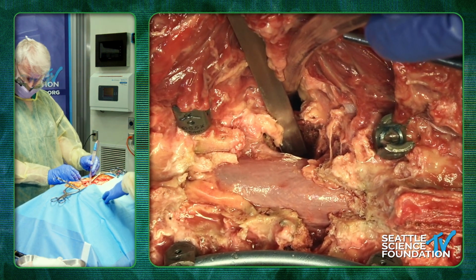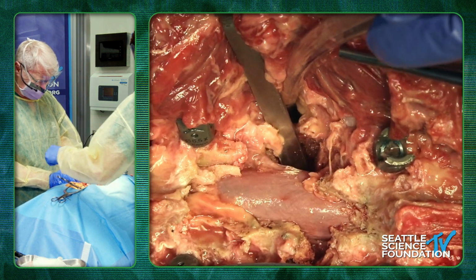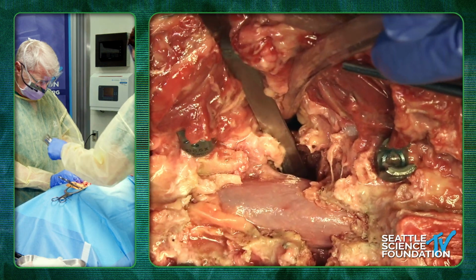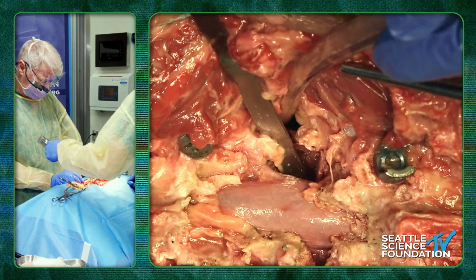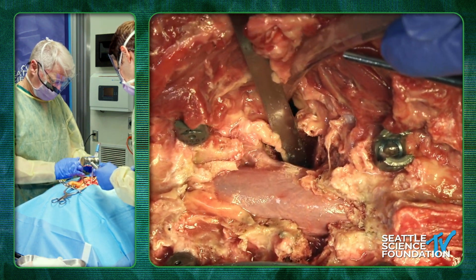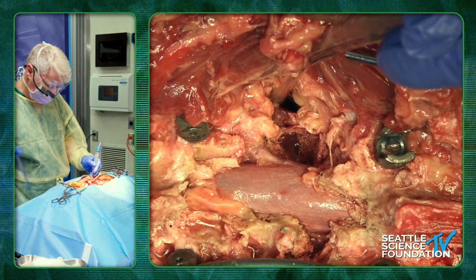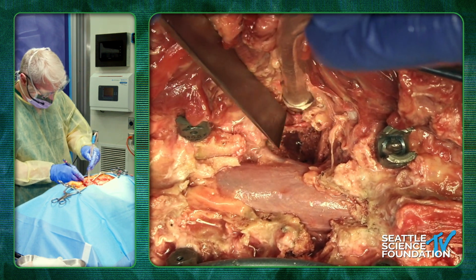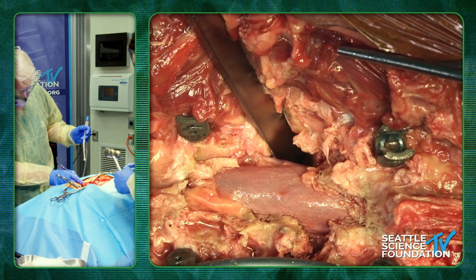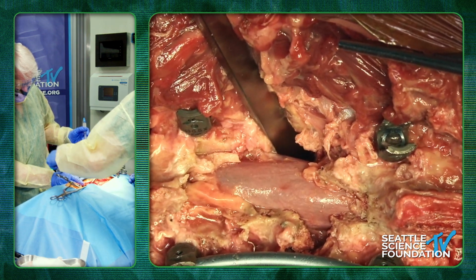Hammer. And we're aiming to the other side now. And so that's going to thin out the back wall. And so the back wall will be nice and thin. And now I'm going to cut into the body. So I'm going to be cutting my wedge into the body. So this is going lateral to medial on an angle, on a triangle.